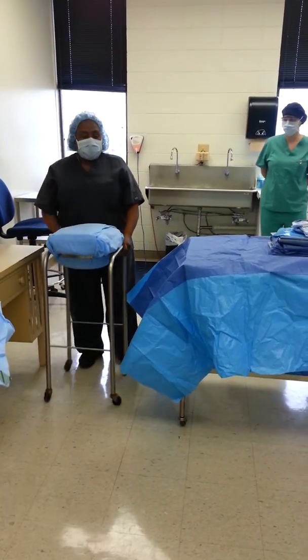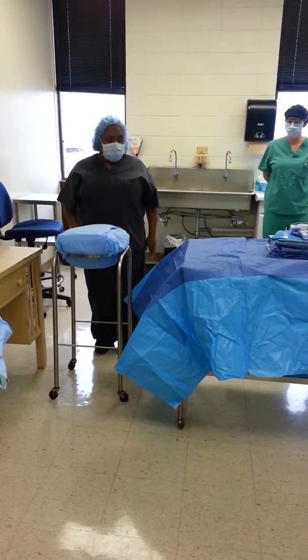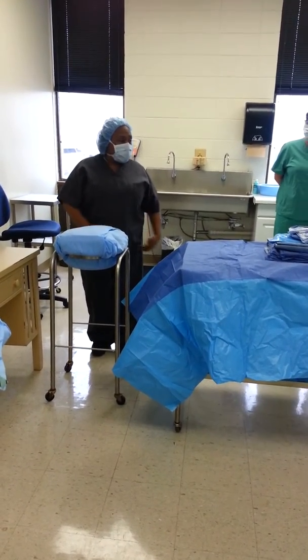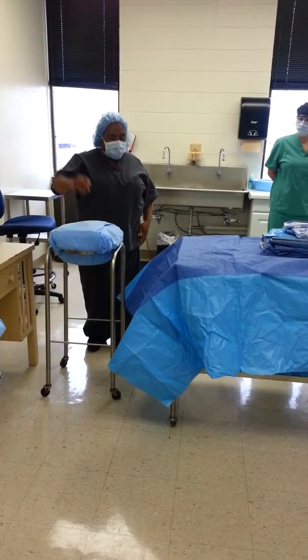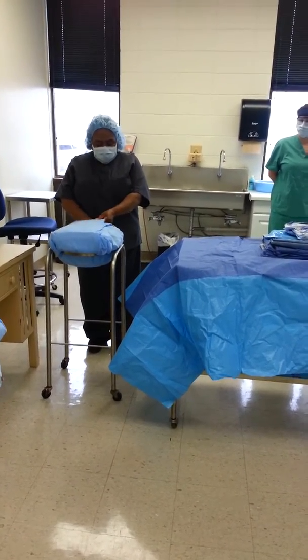Always make sure that you're standing in front, that the opening for the package is to the front. So I'm concerned about this side of my table where I'll be, not that side. Okay, so you press, it tells you to press.